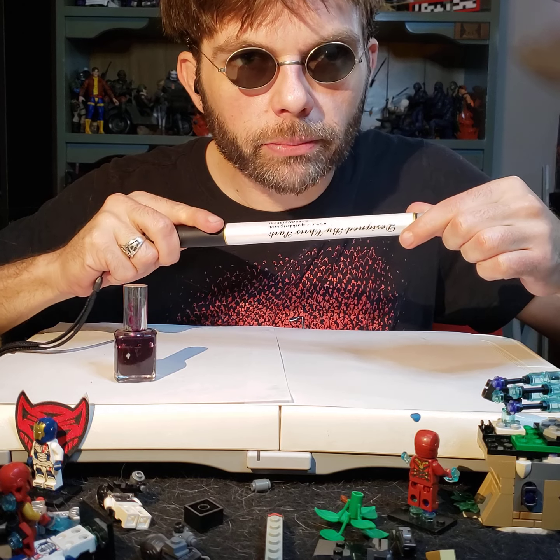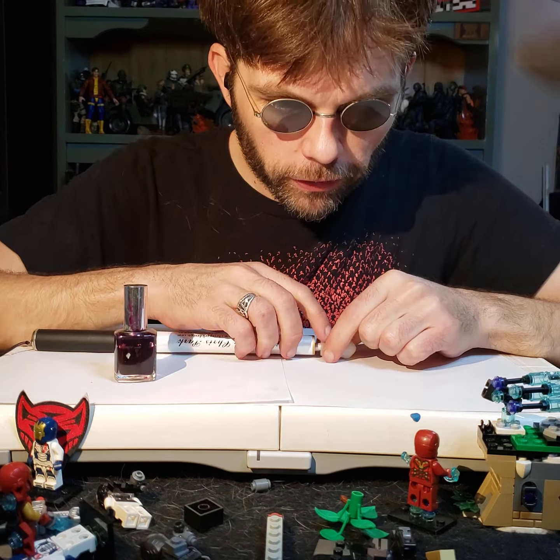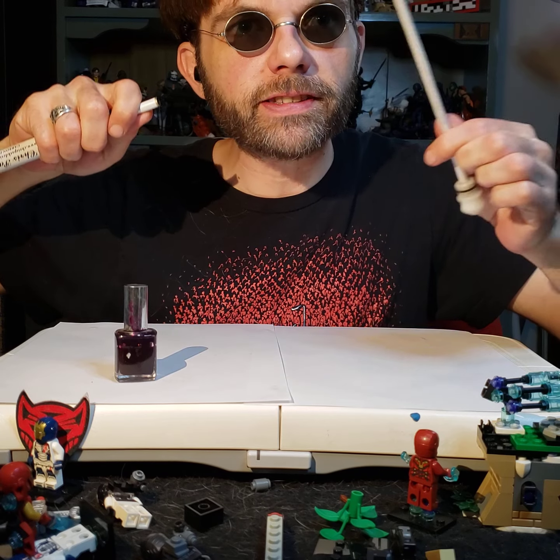The name escapes me right now. And Chris Park Designs, my Chris Park Designs blind cane. So I'm going to inform you on how to repair it because right now, if I pull this cane out, this end pops out. See, this is no bueno.